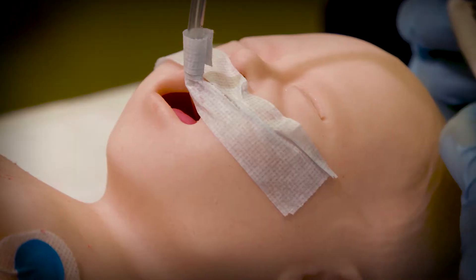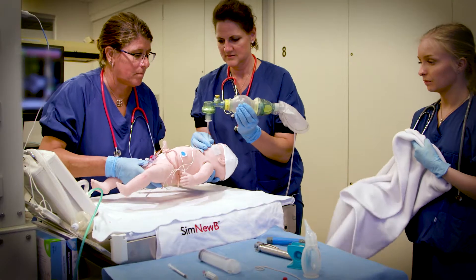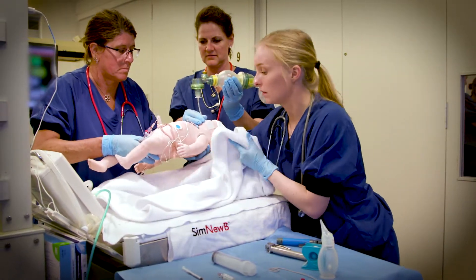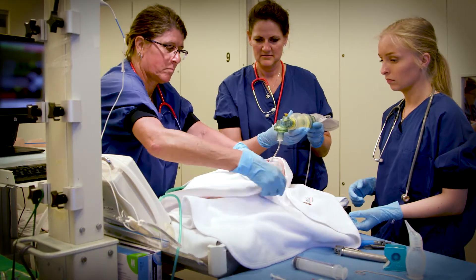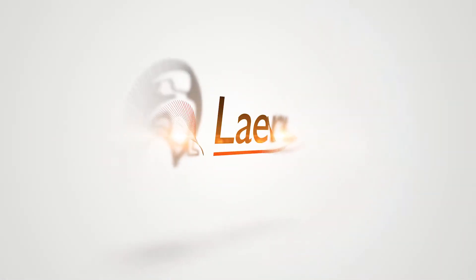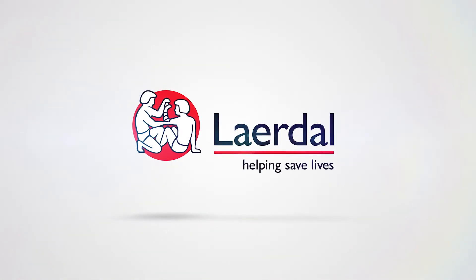Let's get the baby ready to move. Yeah, let's move. Let's get the baby ready to move. Let's get the baby ready to move. Let's get the baby ready to move.